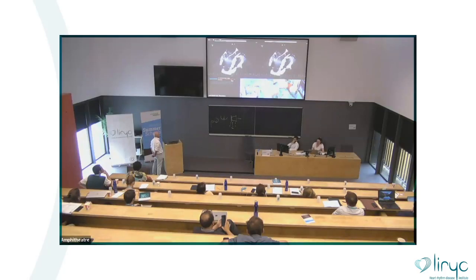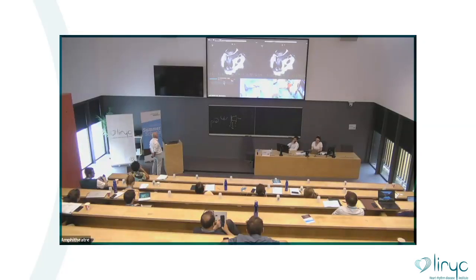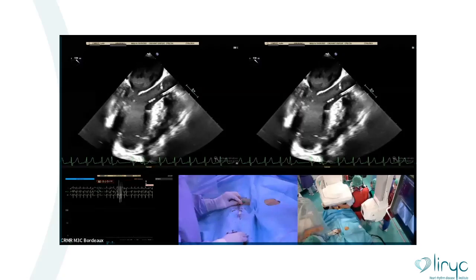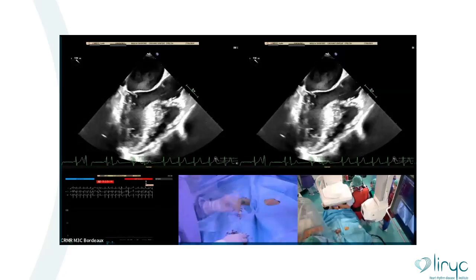But now the tip is looking opposite to the VSD. You have your catheter and your tip is looking elsewhere. Too deep. Pull back. That's a correct orientation, yes. Okay. It's a good orientation. Pull back. You should advance the wire, otherwise we will slide back quickly to the artery.